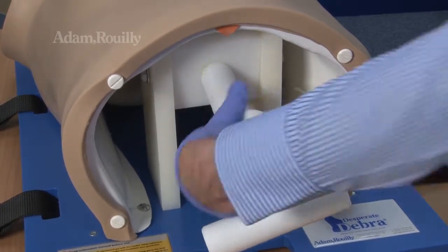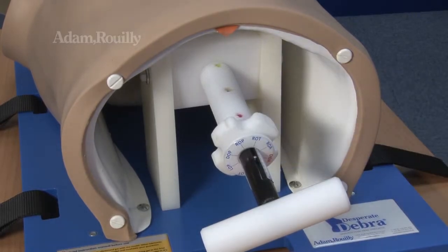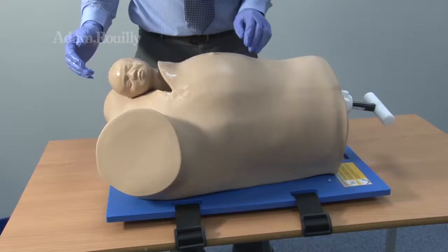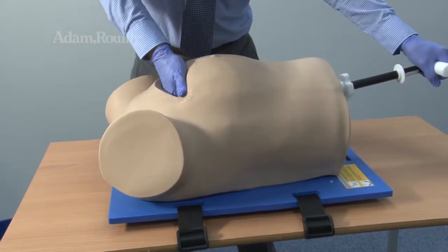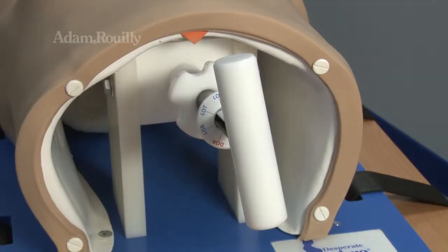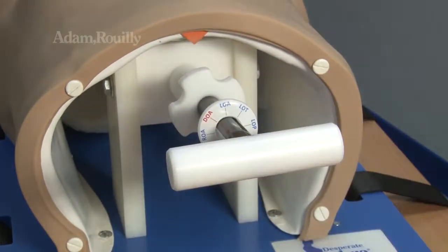Decrease the impaction difficulty adjuster to easy, or when the green marker shows. Insert the fetal head into the model as shown, using the fetal head positioning handle to guide the head into the birth canal. Fetal head axial rotation may be adjusted — align the desired position on the label with the orange triangle marker.